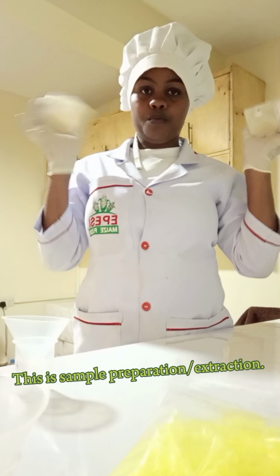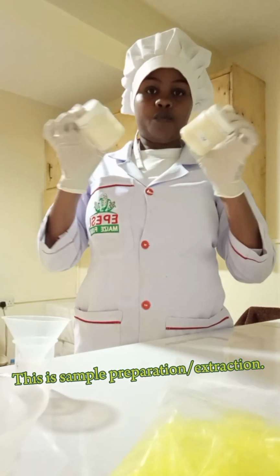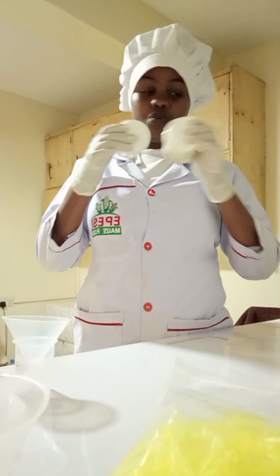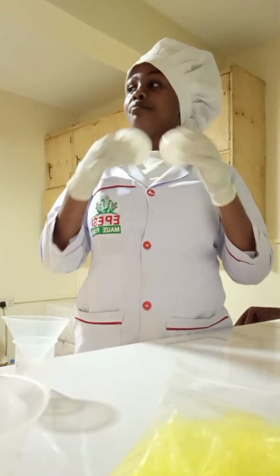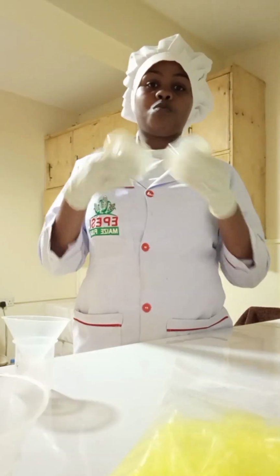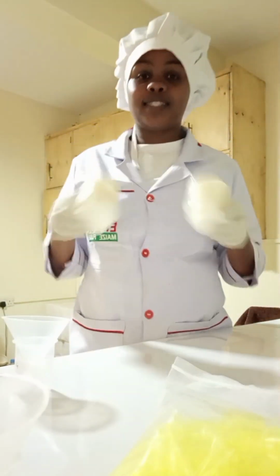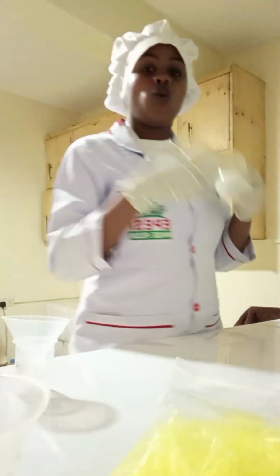And next, now this is the extraction process. That's why I'm shaking. You shake this for 3 minutes. Sometimes those who are in this field understand: when a customer comes, he or she will pressure you, asking if you've finished. Those who don't understand how long the procedure takes find it somehow tedious, but we try our best. So this shaking takes like 3 minutes.